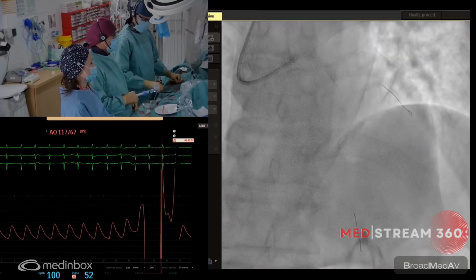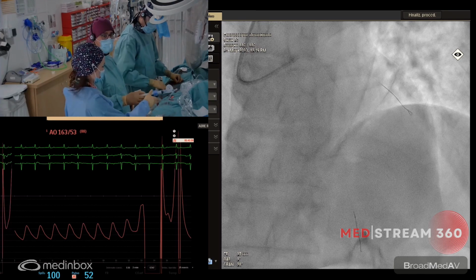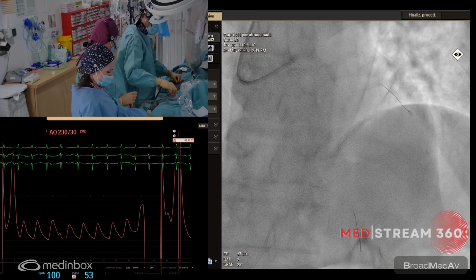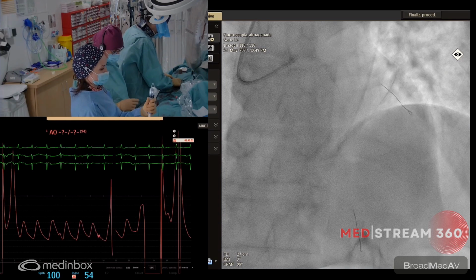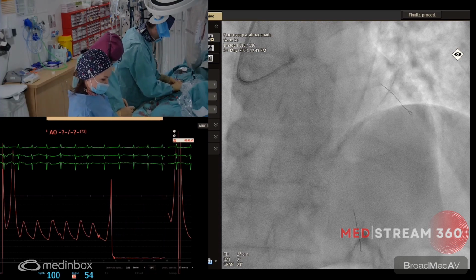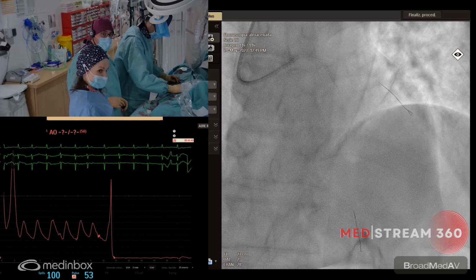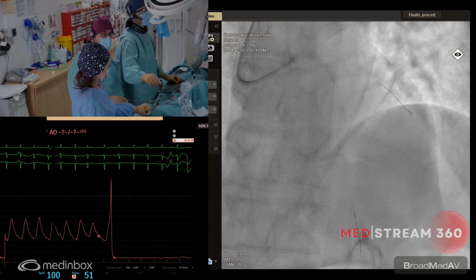Is the landing zone 3.3, no? Test, please. Yeah, the distal landing zone is 3.0. I think all the side branches are there. And the length of the stent is... You think we can go with only one stent, or we need to overlap? I think it's possible only one, no? Because 3.0 and then put 48 millimeters, more or less.